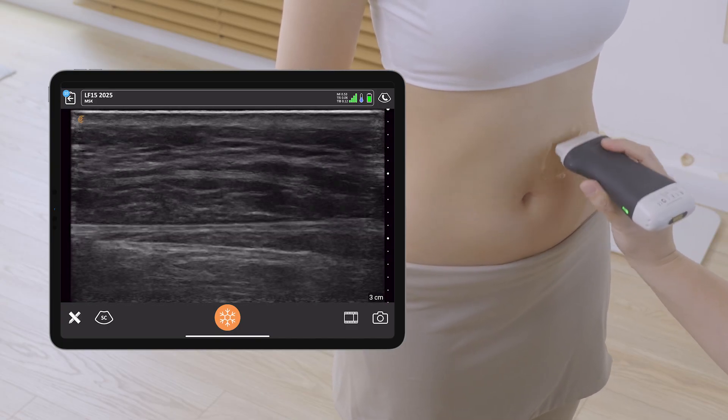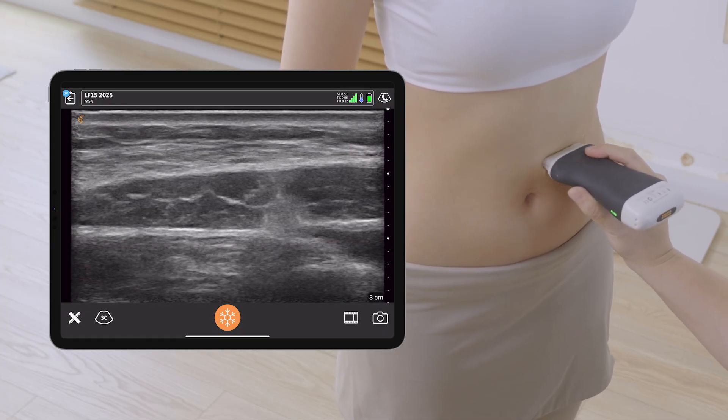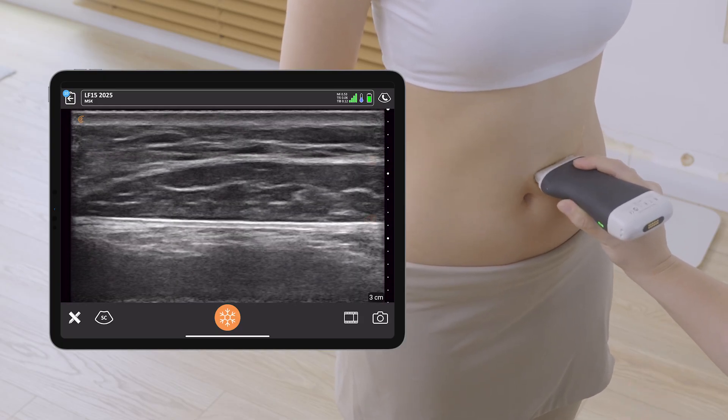The setting I use for this abdominal scan is the MSK setting, because with this setting I can see the skeletal muscle very clearly. I'm explaining to the patient that I'm seeing her rectus.